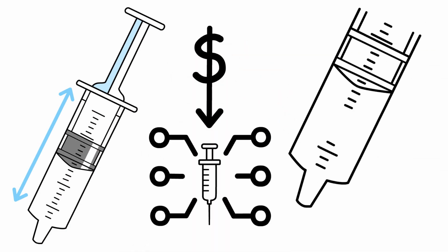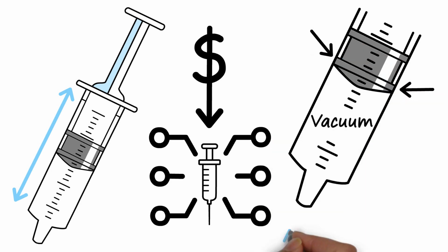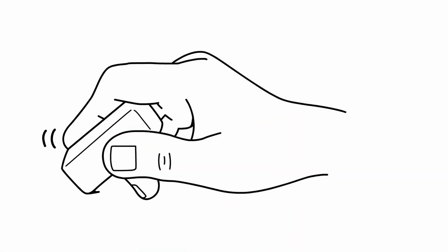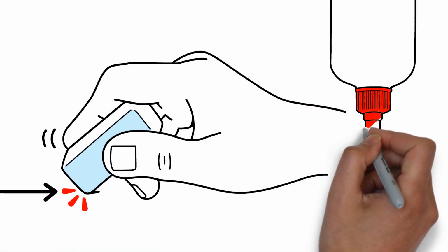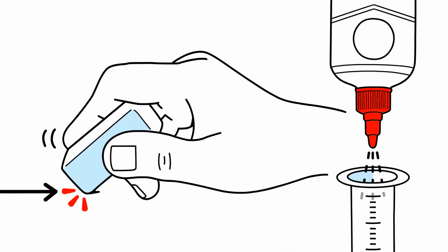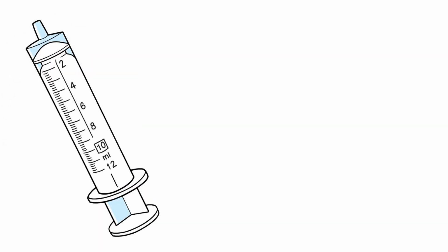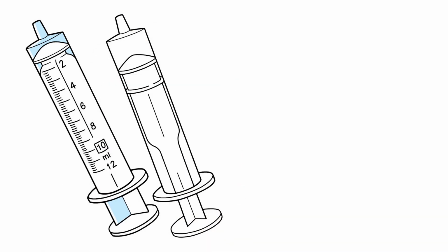The rubber gasket on the tip of the plunger acts as a sealant against the barrel and creates a vacuum for drawing material into the syringe. If you've ever slid rubber against a solid material, you've noticed that rubber tends to be a little sticky. To prevent sticking, three-part syringes use a lubricant, most often silicone oil, which is sprayed into the barrel during assembly. While the two-part syringes discussed previously offer distinct advantages for some applications, standard three-part syringes are used for a much wider range of applications.